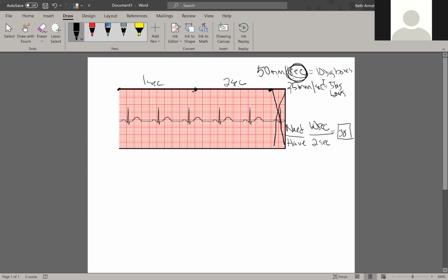So basically, when you count your boxes, whatever is left over, you just scratch out, and you don't count if there's ever a P wave in there. Correct. Whatever's left over that you can't count, you're just not going to count any of that stuff that's left over. Okay. And what about at the beginning of your strip, if there aren't 5 little squares inside of your box? Do you not count it at all because it's not a full square?